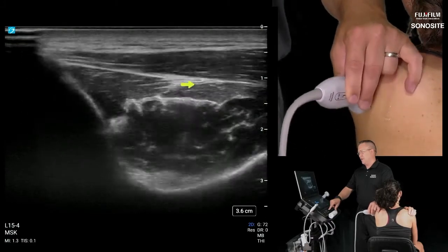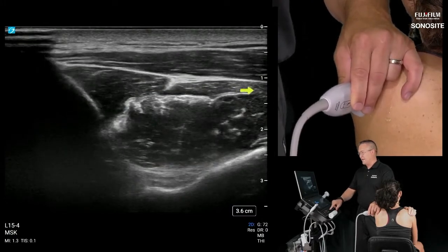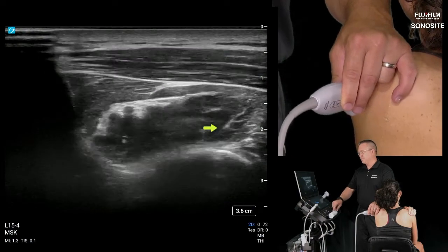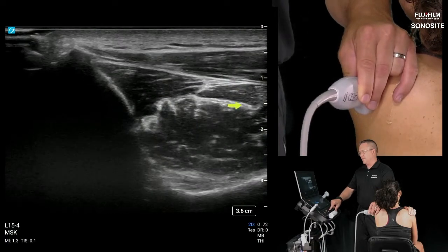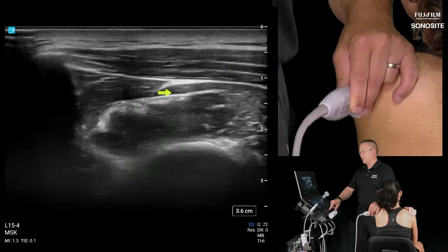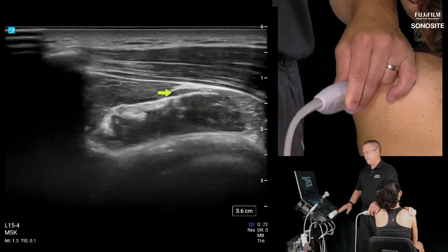So carry that into your clinical exam if you're curious about fatty atrophy. Fatty atrophy will look like a grainy rind around this cross section of the muscle, and you'll almost see the outer edge of the muscle taper in and look exactly like this tendon. So there won't be this hypoechoic normal gap of muscle, for example. I'm going to use this view to get us down to the teres minor.